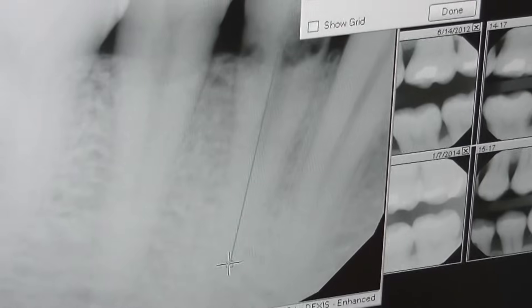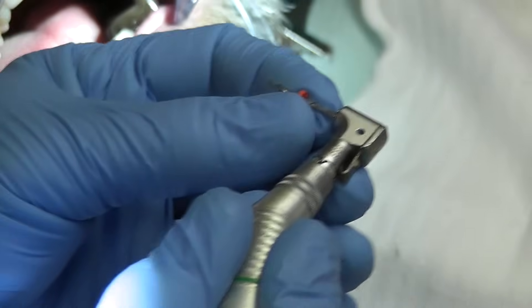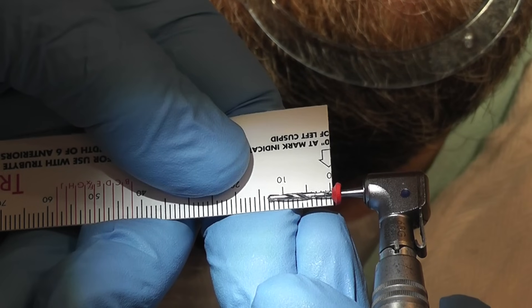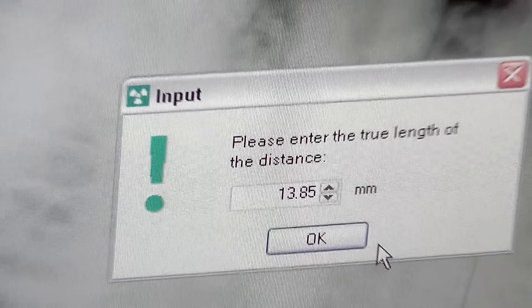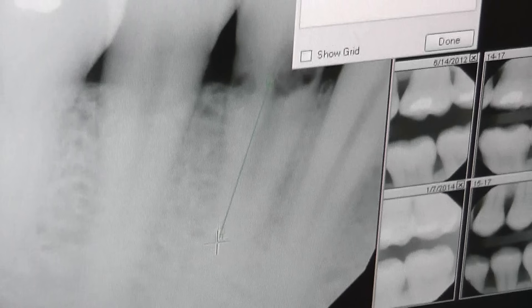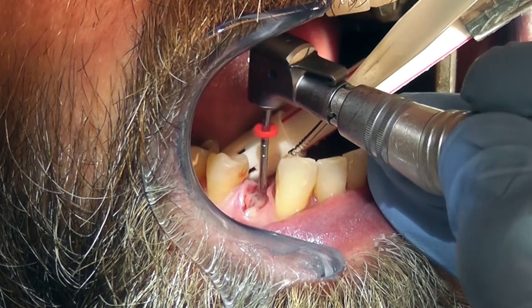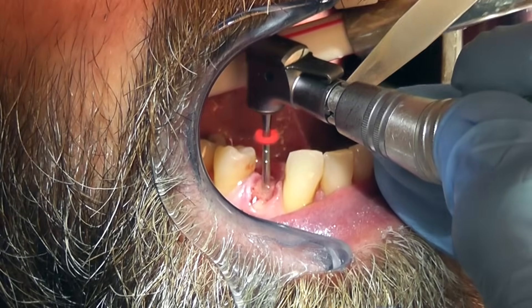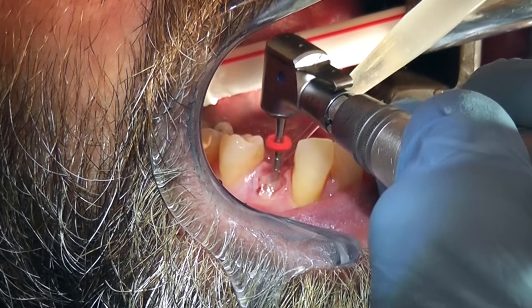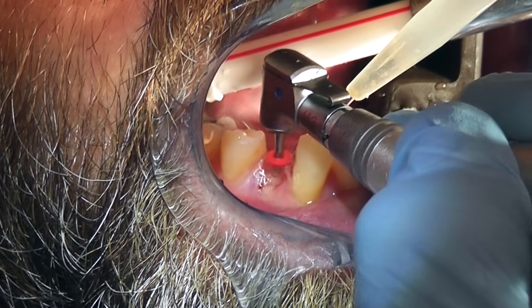I first measured the root with our digital imaging system, and with the first drill I'm placing an endo stop at the predetermined length — I don't want the drill to go past the apical end of the root. Then use the specially designed Easy Extract pilot drills to create a canal inside the root. Use a lot of water and place the drill right in the root canal. This is a slow-speed dental handpiece; you start with the white drill, then use the red drill, and finish with the blue drill.